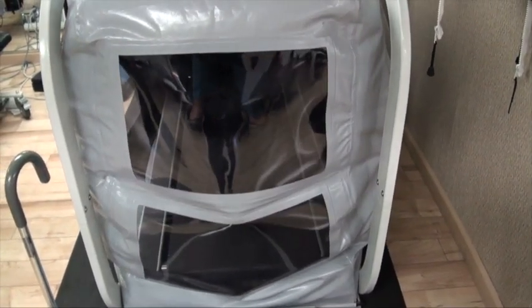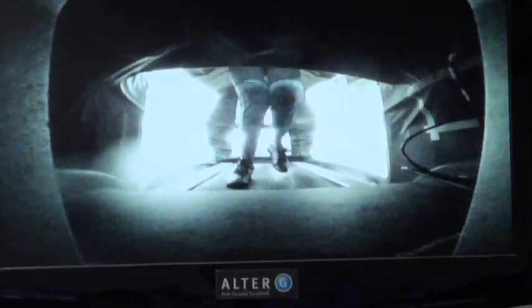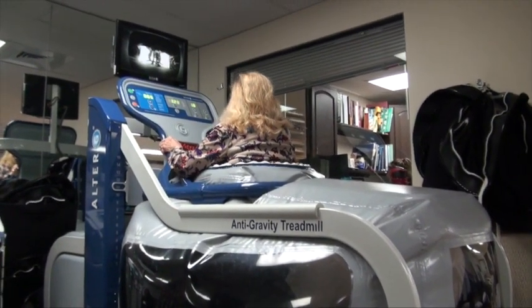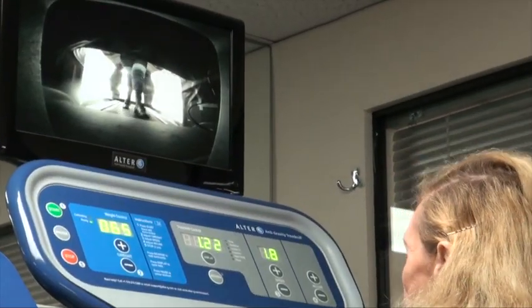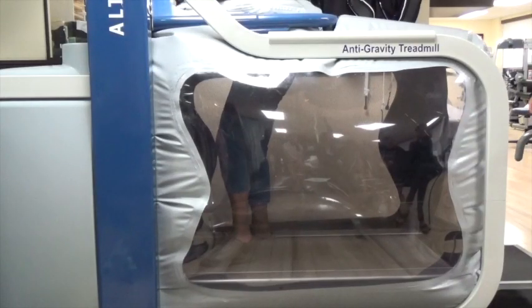Her normal gait speed is 0.7 meters per second, but on the Alter-G she is able to reach 1.9 meters per second for 10 minutes. The comfortable support of the Alter-G means longer rehab and training sessions, and with the patient secured in the chamber, it allows for exercises to be performed safely.